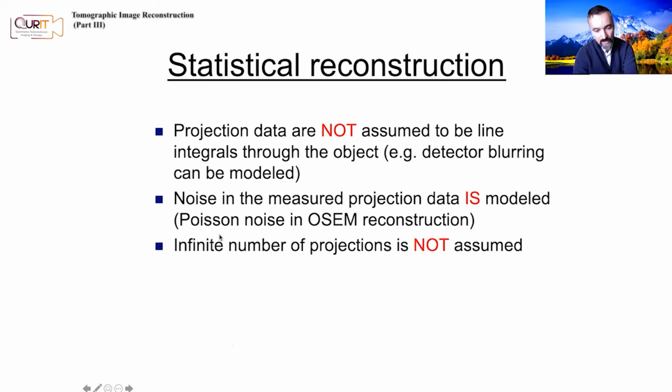And finally, you do not have to have an infinite number of projections or even a tremendously large number of projections. You could have less number of projections and still do a good job.